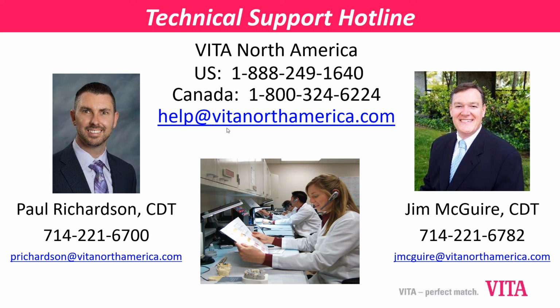So I have some at 0.6, 0.7, I have one at 1, and I have one at 2 millimeters. Since they're half round, like a nail, it's almost like half a crown or a veneer. When the doc does the prep, I have those glazed in a basic shade. Then I put the try-in paste and slide it on top of the prep and underneath the gum, and I can see exactly what it's going to look like.